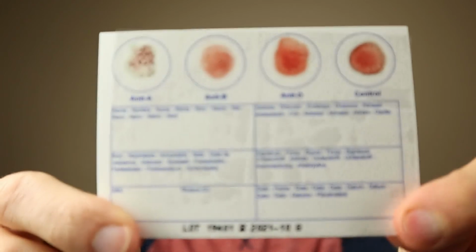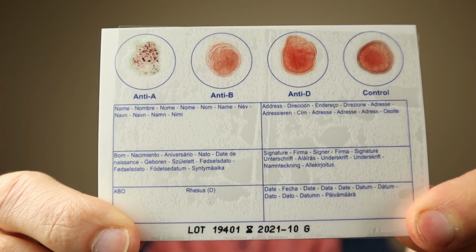Once your Eldon card completely dries, you can then take the Eldon foil, which I showed you earlier, peel off the backs and place it on top of your Eldon card to protect it. And that is how you can easily check your blood type at home using the Eldon card.